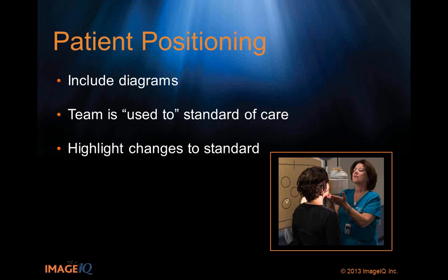The other thing we've mentioned already is that your team is used to the clinical standard of care. Your x-ray is a great example. You may want a hip x-ray positioned a little abnormally to make sure that the implant is completely visualized and you can see all the soft tissue, so you may want it tweaked differently than clinical care. The technologist is used to doing a hip; they've done it their entire career. So really document the differences and the changes to the standards that they use. Maybe it's that one MR sequence that you mentioned. Hopefully it's not the whole hour.